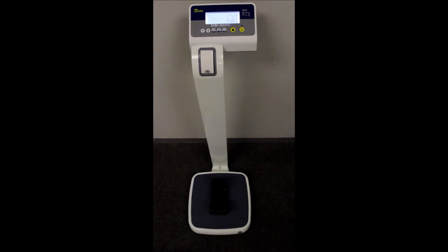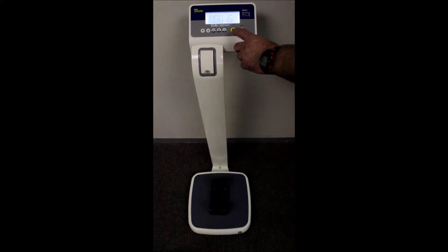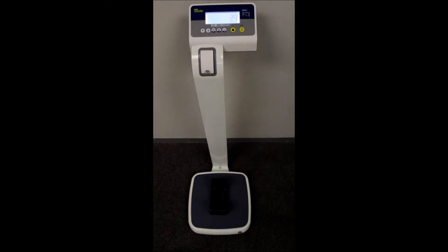For BMI functions, stand on the scale and press the BMI button. It will show you the height. Enter in your height and press zero, and the scale will indicate your body mass index.